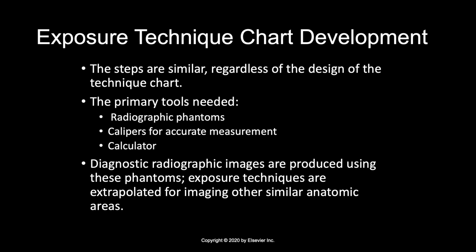For example, a radiographer knows what exposure factors to use with a particular radiographic unit for a knee that measures 10 centimeters. And we're doing this knee in an AP. So we'll do an AP knee on a 10 centimeter knee.